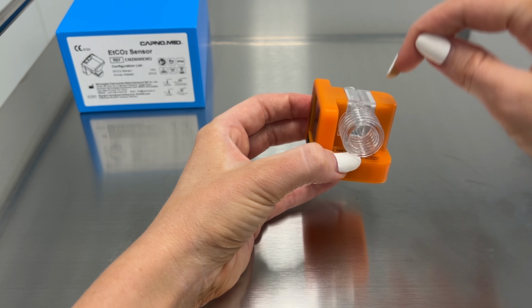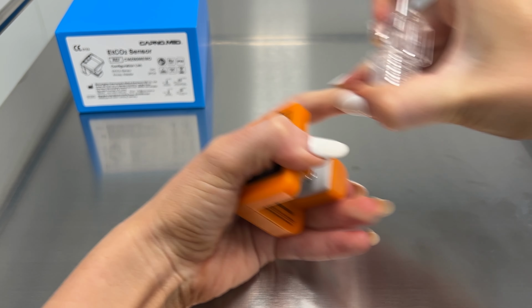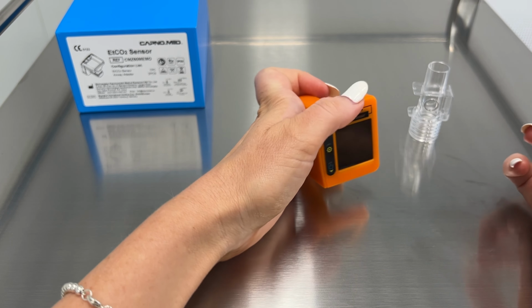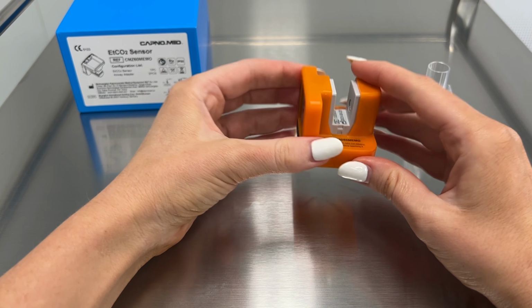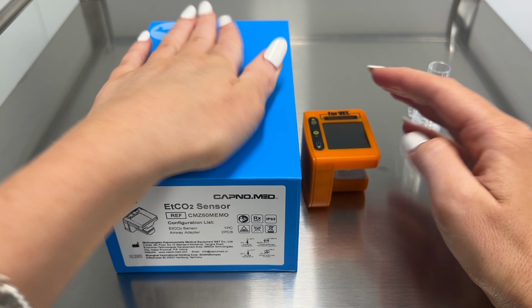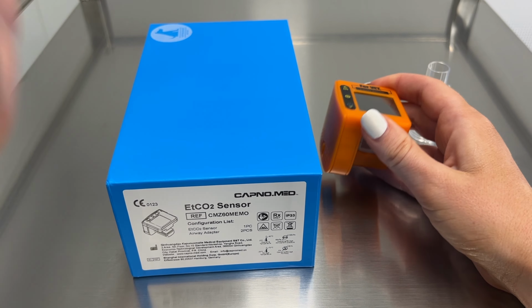At the end of every use, you need to be removing this and storing it away nicely, making sure that you are storing it in an upright position so that if there is any condensation in there, it can drain out. I would recommend storing this little device in a clip lock container, if not in its original box, keeping it out of the way of any kind of debris or getting soiled or getting wet.